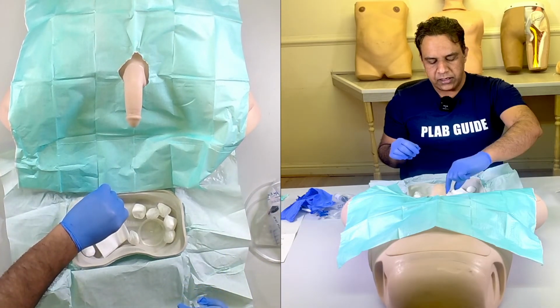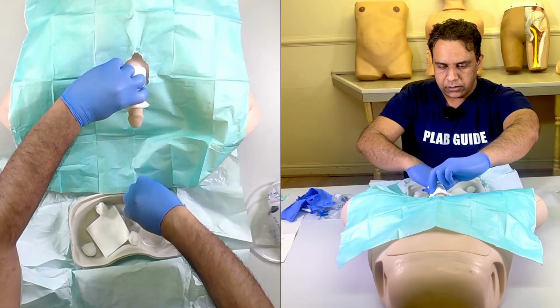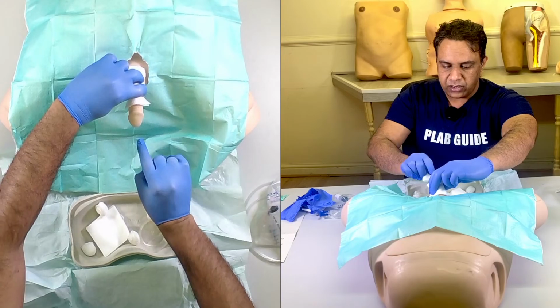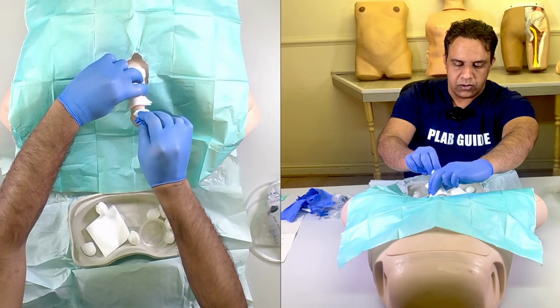The next thing that you want to do is throw this on the penis and hold it and clean the tip of the penis 3 times, moving away from the meatus. We should clean it in a circular fashion.